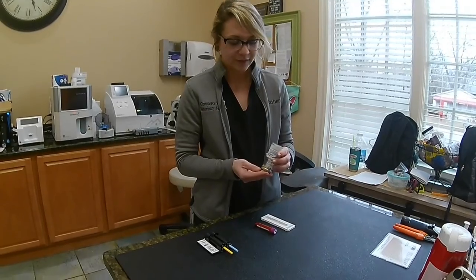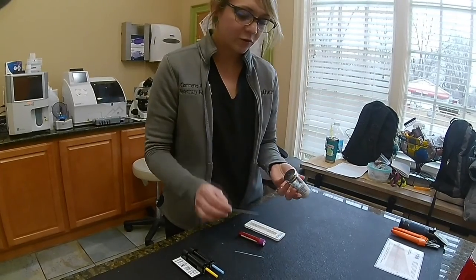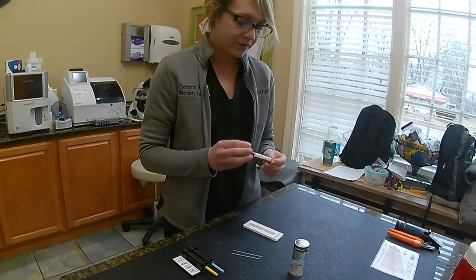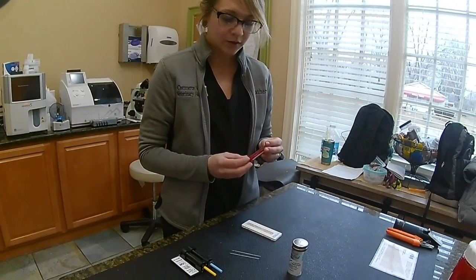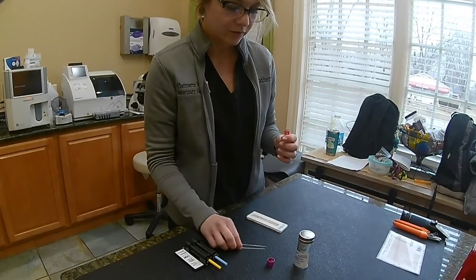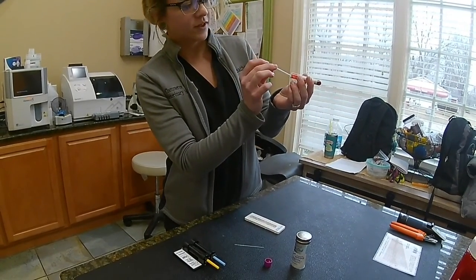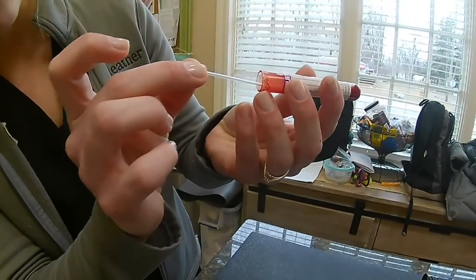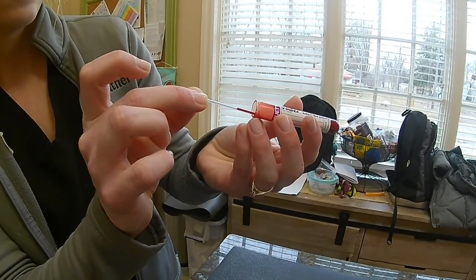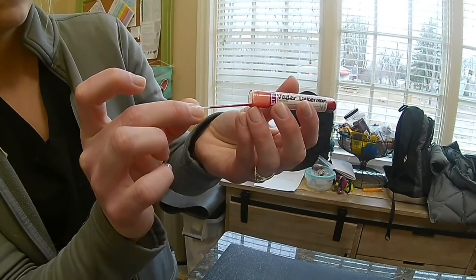Oh, and I'm going to shake them out here. We're going to do 2 of them. 1 for balancing, and 2, it's also good just to have kind of a backup. So I'm going to invert my sample a little bit here. Gently mix her. Ideally, we want to do 3/4 of the tube full. So I kind of just set the tube in here and let gravity start taking. There we go.